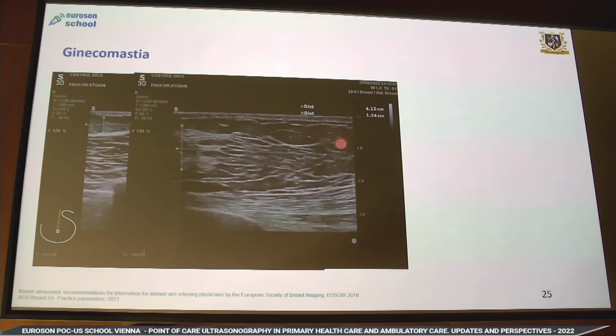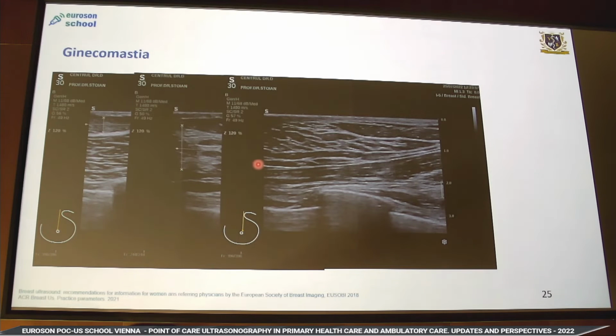But in this situation, besides the clear fatty tissue and the muscular plane, here is already a lobe, which is fibrotic, which has no epithelium at all, which has no tumor inside but is there. So this is an inactive gynecomastia that has to be re-emphasized, that it exists, and this male should be attentive with his evaluation. This is the same, a very nice image. This is not adipomastia. This is a ductal remnant. I think this is the best way of thinking from the anatomical point of view as a clinician.